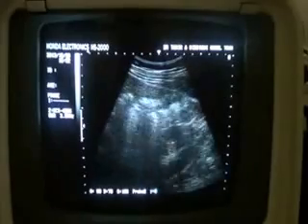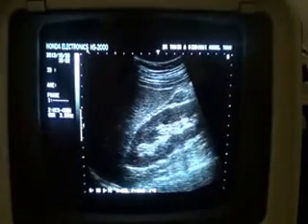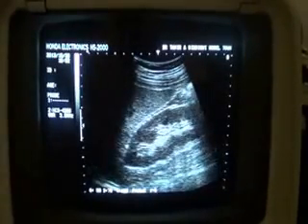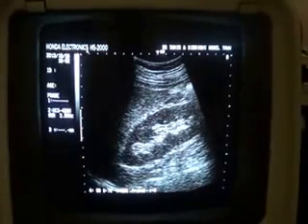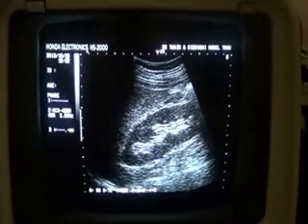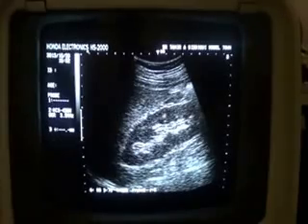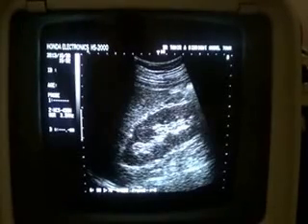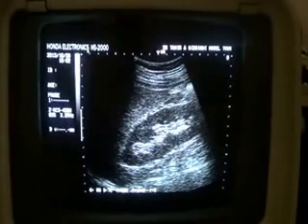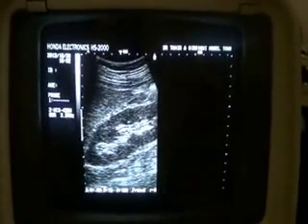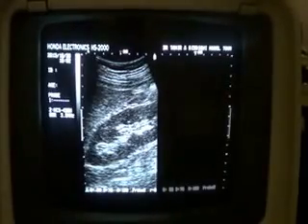Now, what is the normal kidney parenchymal echogenicity? This is my own kidney — not the patient's — and I want to show you what a normal kidney looks like for comparison. You can see the central sinus echo complex and the echogenicity of the kidney, along with the pyramids. The echogenicity and brightness of the kidney is normal, slightly less than the liver. If you compare this kidney with the patient's affected kidney, you will notice a clear difference.